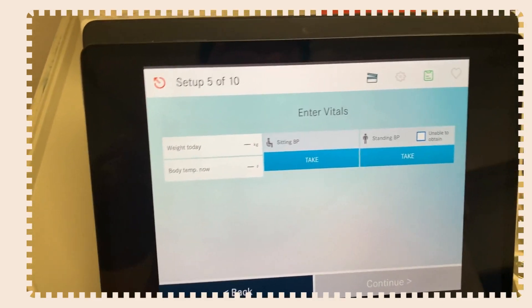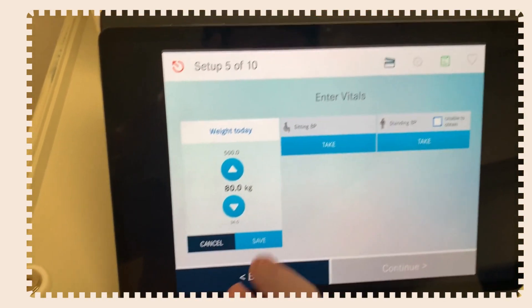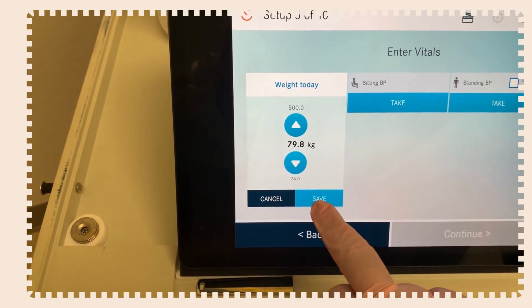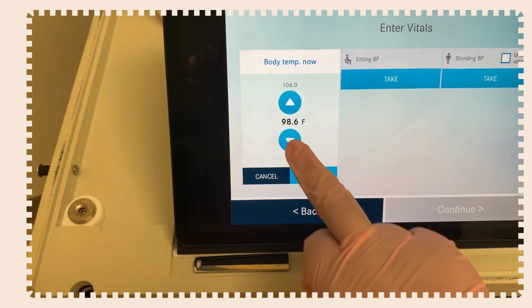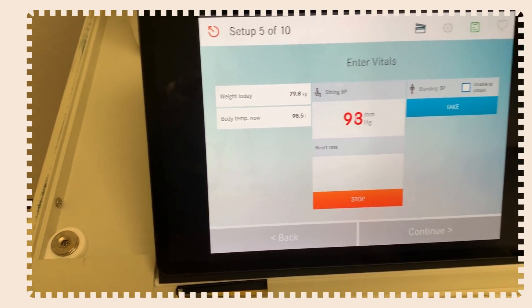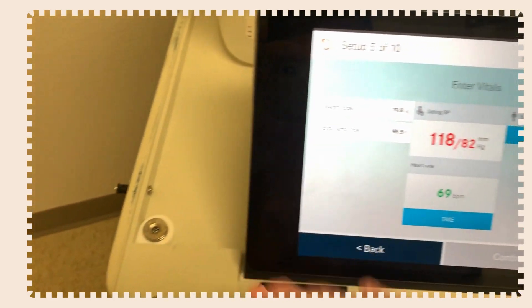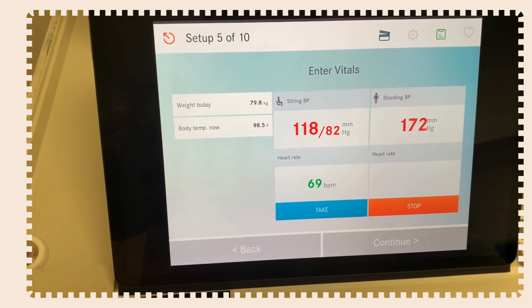While the machine primes — keep in mind this is a demo screen — use the up and down arrows to enter your target weight. You weigh yourself before and after each treatment. Check your temperature. Then take a sitting blood pressure and a standing blood pressure, placing the cuff on top of the machine. You want both readings so you can compare them at the end of treatment.